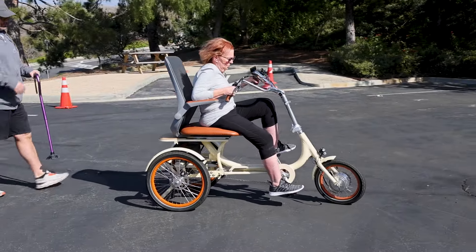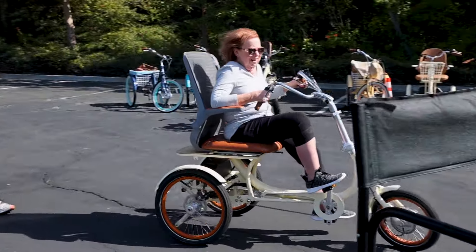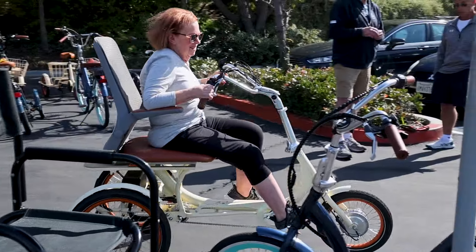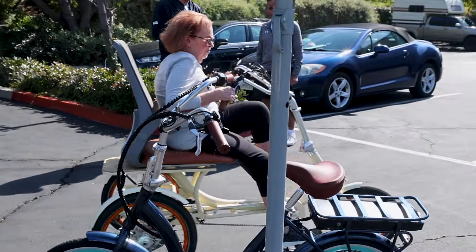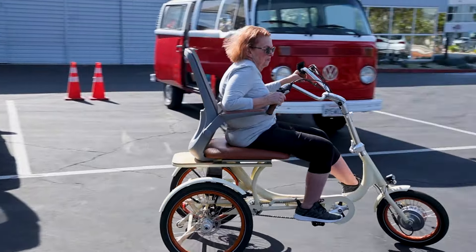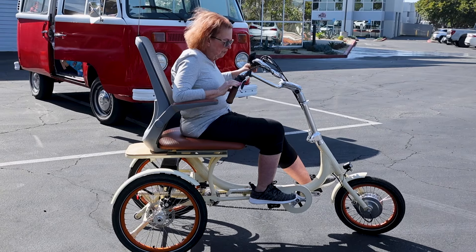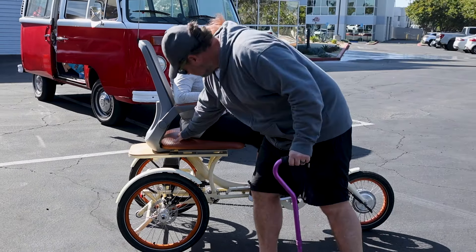She's cruising around — you can just make a loop. The reason she's struggling is the seat position. I noticed this — it's all going to be fixed. We need to get that seat about seven more inches forward for her to really get a comfortable pedaling position.